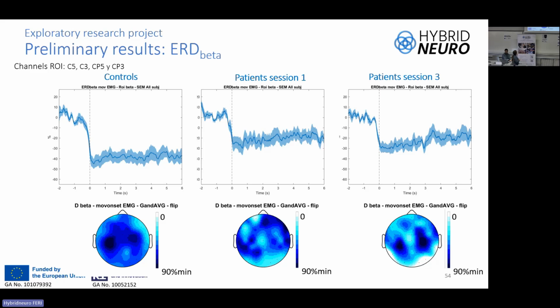So this is the potential in the control subjects again, and the localization is mostly in the contralateral side. I also forgot to say that we have patients that have a dysfunction of the left or the right hand. This is the control, so actually this is all directed to the right hand. And we can see that this peak is mainly reflected in this area, as was expected.